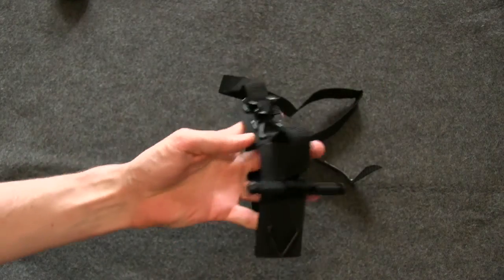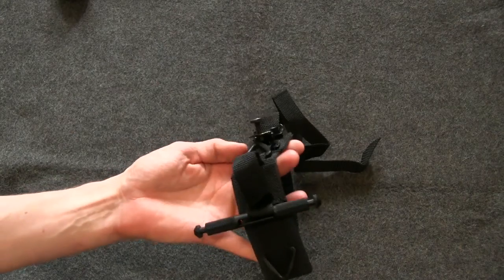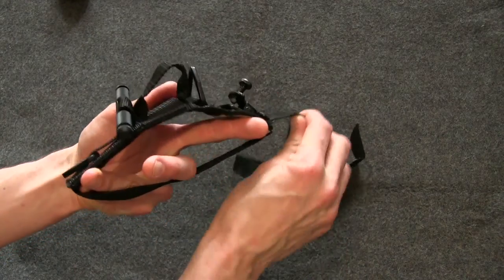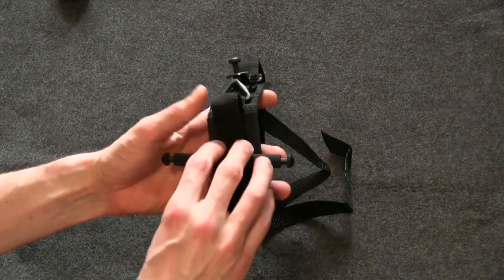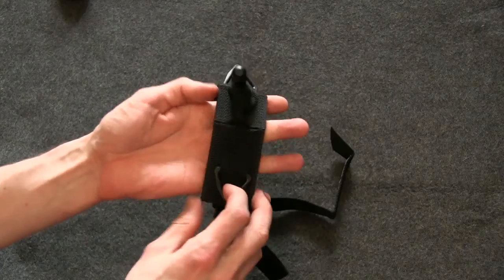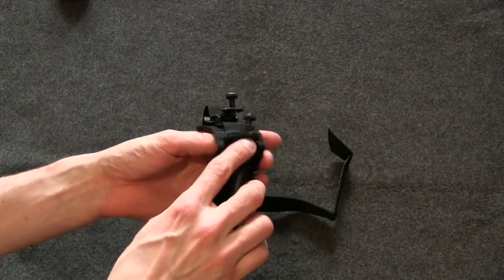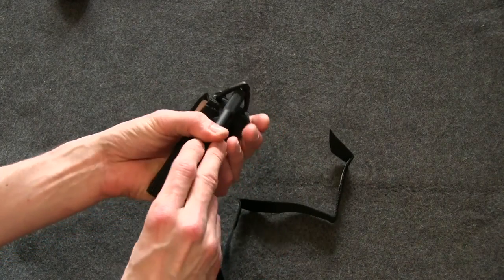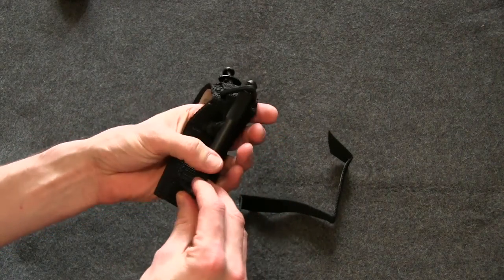And of course, I'm not going to show how these work because they are not toys that you can just play around with, because there's a serious risk of nerve and blood circulation damage. But anyhow, the major operation would be that you would have this around, let's say, your arm or your leg or whatever, and then you would just turn this around and lock it onto one of these loops or D-rings or whatever, and one is quite sufficient. So even if you have it only from the one end, it still works sufficiently. Of course, you may try to have them both in this kind of setup, but it's not really necessary.